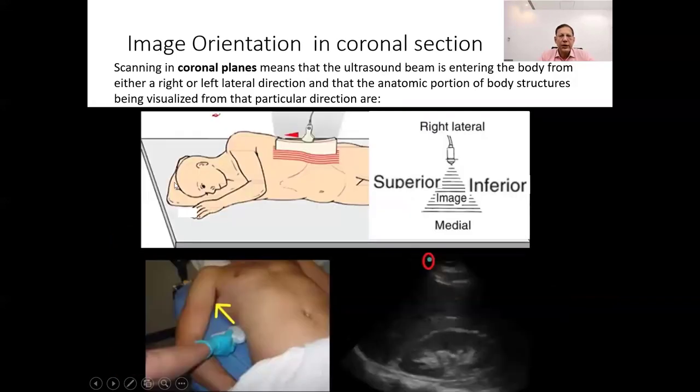When we scan in coronal planes, we're imaging the body from a side view, either from the right or left lateral direction. The ultrasound beam enters the body from either the right or left side, meaning we're looking at body structures from a lateral perspective rather than from the front or back. From this lateral direction, we can visualize different anatomical portions: lateral — structures away from the midline; medial — structures closer to the midline; and superior — structures above the point of entry of the ultrasound beam.